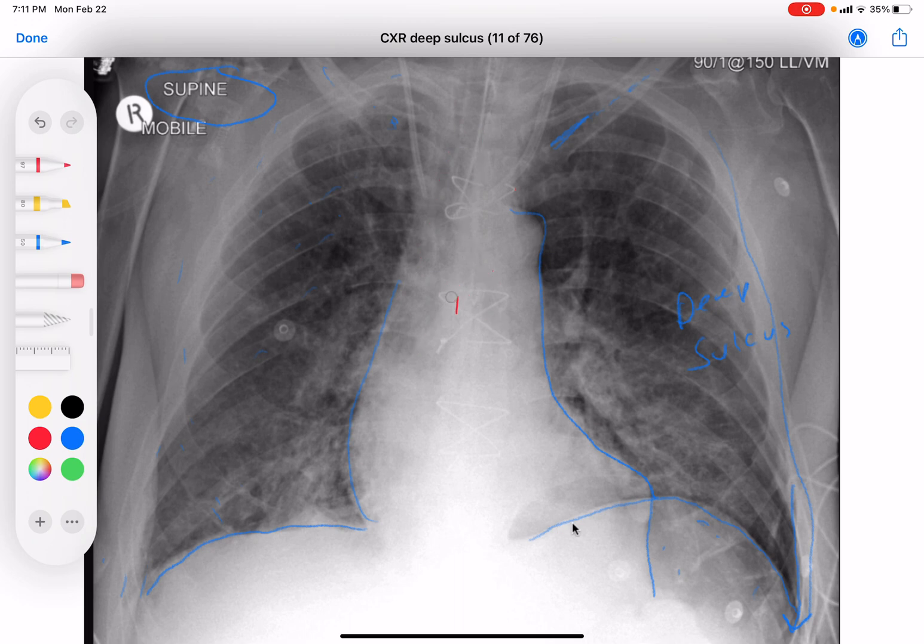Besides the deep sulcus sign, there are some tubes and lines we need to talk about. There are a couple of central lines. Here's one coming down — the tip ends right there, but the carina is way down here, so that needs to be advanced quite a bit. It should end up at the carina or a centimeter below. Here's another one that looks like it stops here — this one especially needs to be advanced because where it is, it could be up against the wall and at much higher risk for perforation. Both of these need to be advanced.